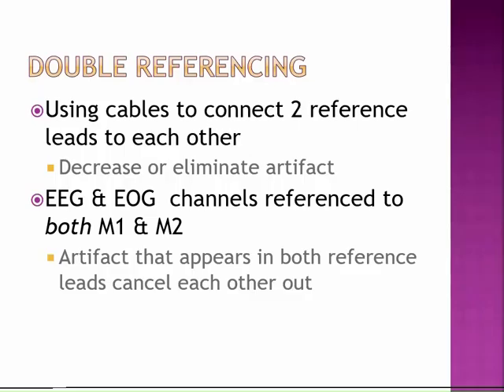And so the reason why we apply these reference electrodes is they're picking up all the ambient electrical activity in the patient's room, as do all the other electrodes that we apply. You have these active electrodes, or what's known as exploring electrodes, that you apply because we want to pick up these signals. Your C3, C4, O1, O2, F3, F4 are placed over an area of the brain where we want to record the brainwave activity.